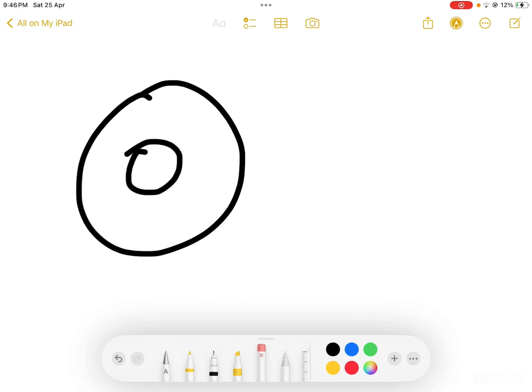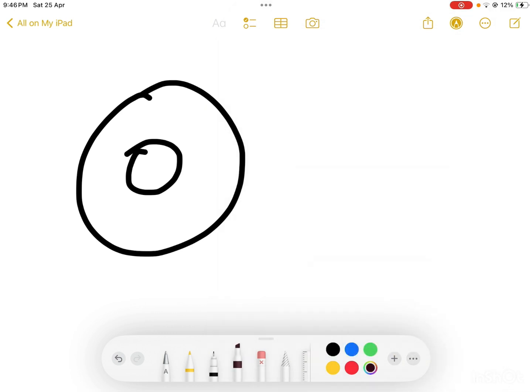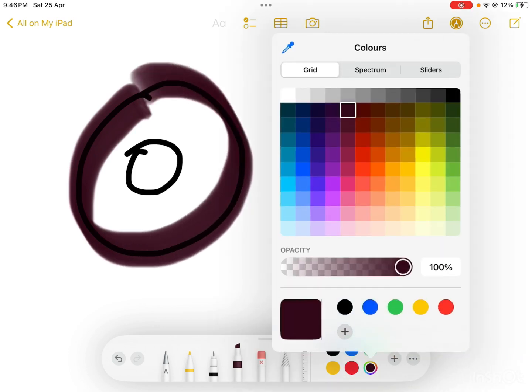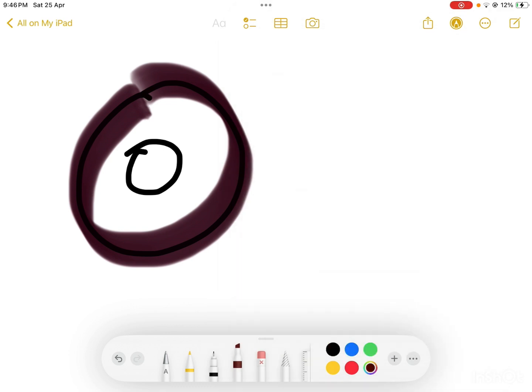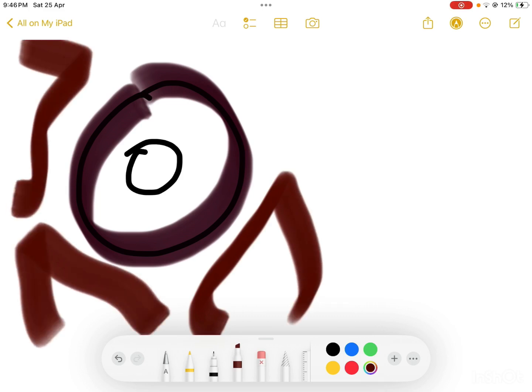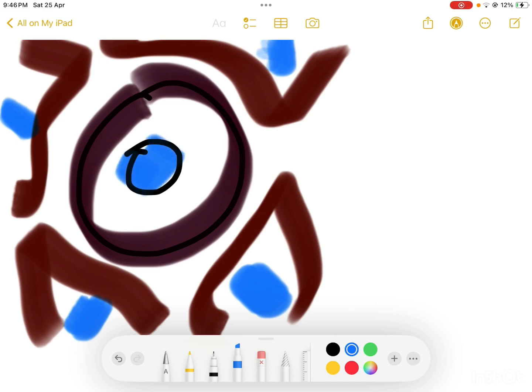Then you will have the last one, that is the membranous positivity. Now this became maroon color. Anyways, so membranous positivity, how you will see, this is not round as such. So here you will be seeing the membrane. While doing IHC, it will be seen very membranously, and then you will see the nucleus, that is here, nucleus here, nucleus here, nucleus here. So this is how you see the membranous positivity.